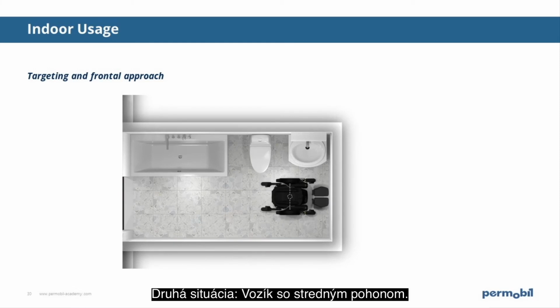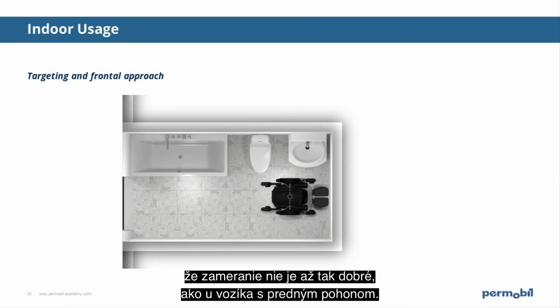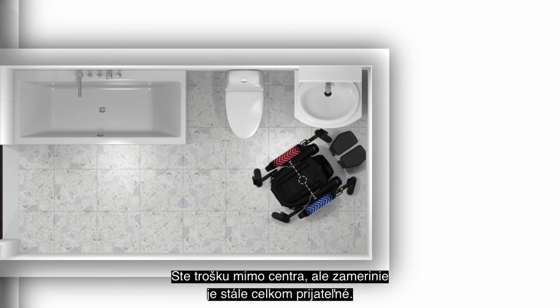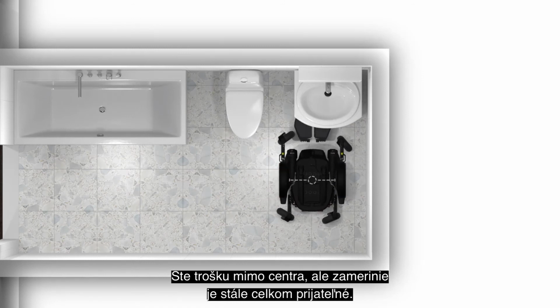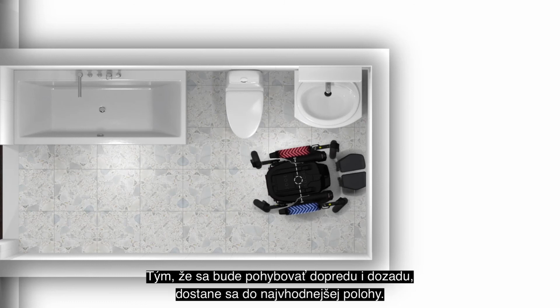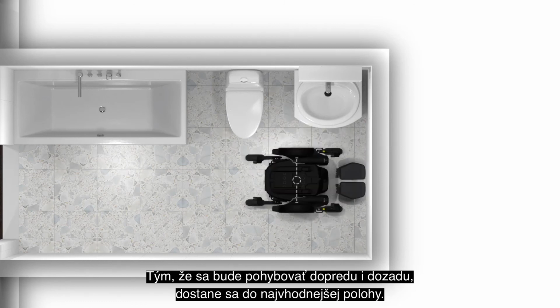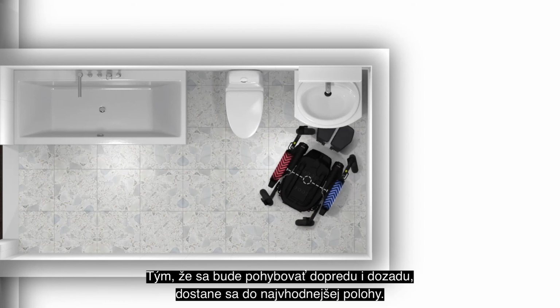The second situation is with the mid-wheel drive platform, and there the targeting is not as good as with a front-wheel drive. You're slightly off-center, but the targeting is still very acceptable. By moving once back and forth, your customer can also position himself in the most convenient and optimal position.